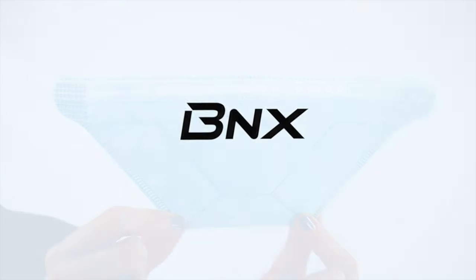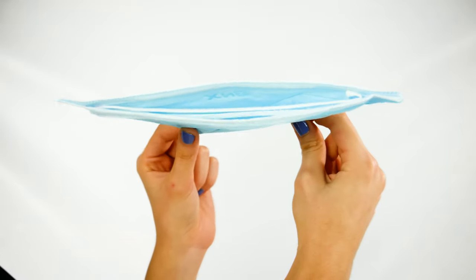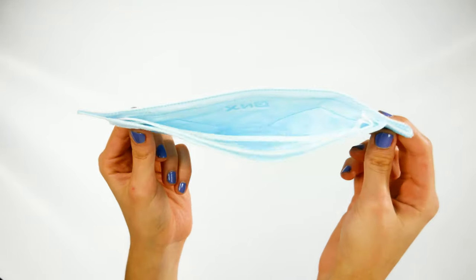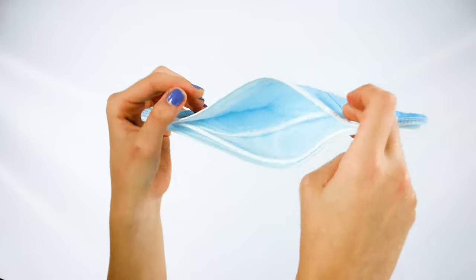Hello and welcome to this BNX tutorial. Hold the mask and unfold it. Gently make a slight bend in the nose piece, forming a modest curve.